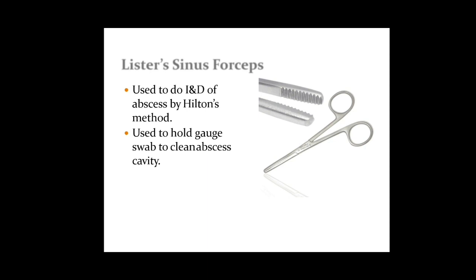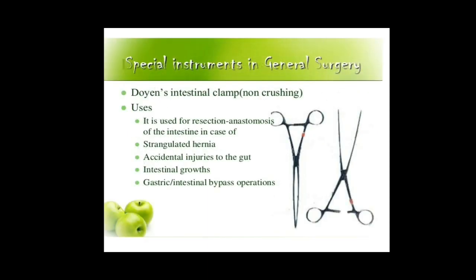Alligator forceps have a 45-degree angle grip and a small set of serrated jaws at the tip. At this tip you can see there is a 45-degree angle of the grip, so it will hold any object. For example, if there are any foreign bodies in the ear or nose, these forceps can be inserted, hold that foreign body, and remove it.